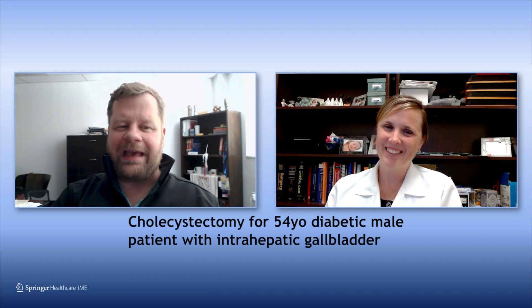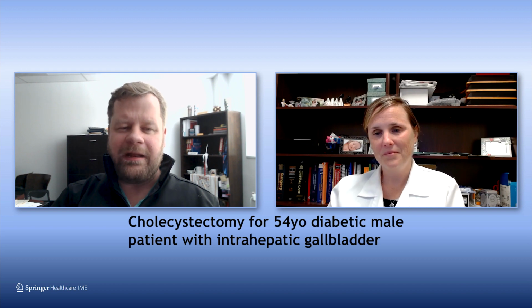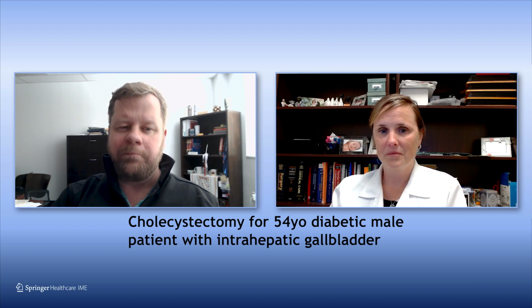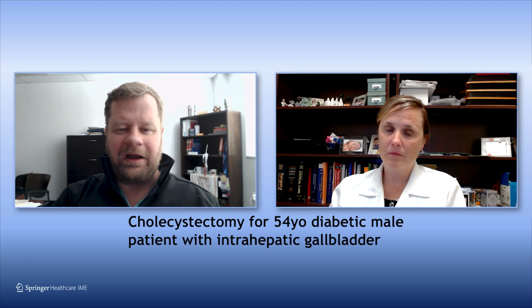So in some ways, the ideal situation is having appropriate planning. And in reality, sometimes it's: let me think about the steps before I glibly apply one of these, to make sure, A, I have surgical bleeding control, but B, I'm not wasting what I'm putting in there and not just running roughshod over the operative scene before waking up and going on to the next case. Because liver ooze, and we'll talk about other cases, can be a real problem. And it is, I would say, easy to control if you're thoughtful about it.